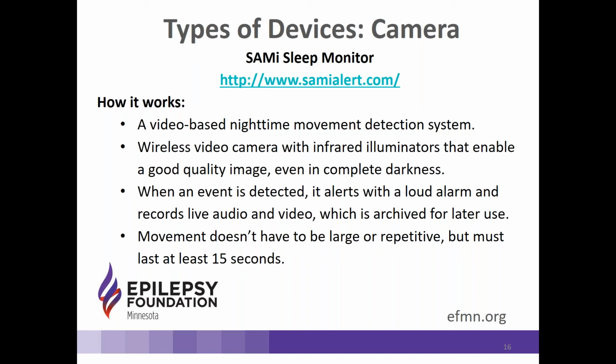When that recording of the audio and video starts, it also timestamps it so that you know what time the event happened. In the case of this, the movement doesn't have to be really large or repetitive, but it does have to last at least 15 seconds before it will trigger that audio and video recording.